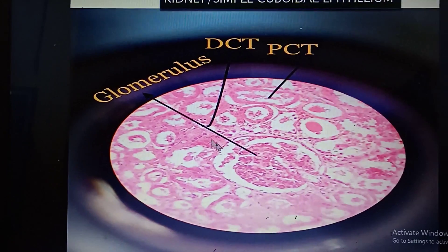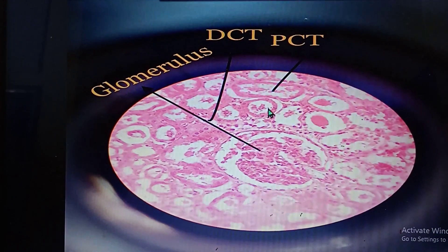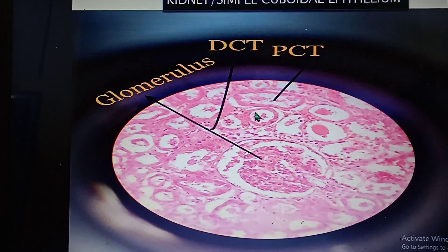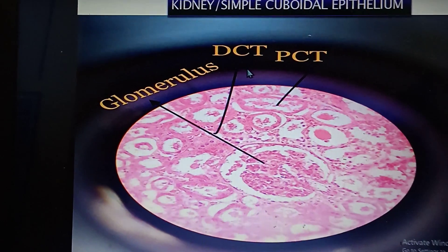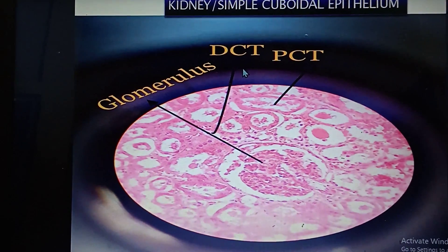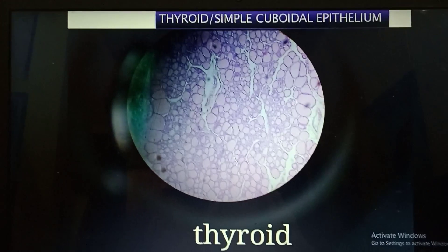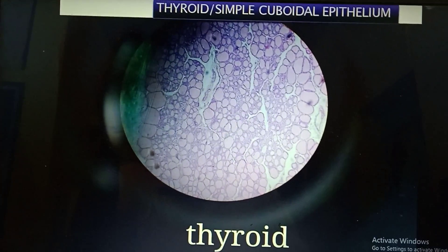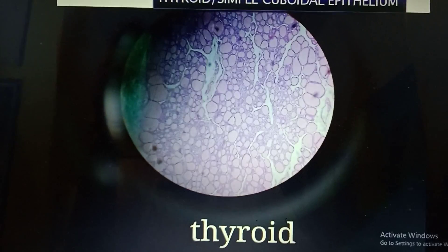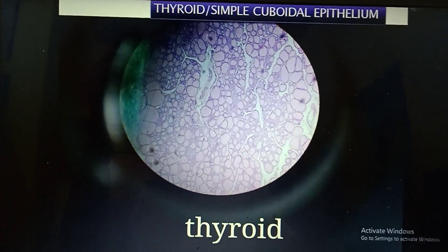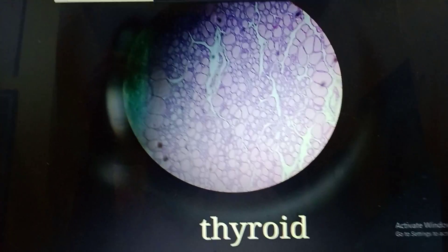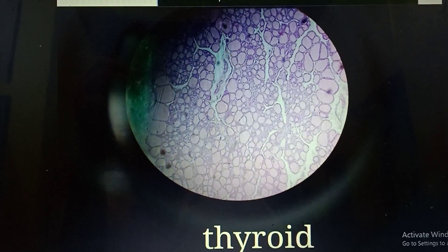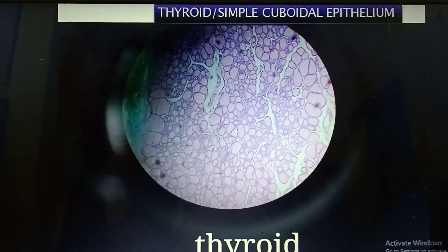This is simple cuboidal epithelium found in the kidney in the proximal convoluted tubule as well as the distal convoluted tubule. This next slide is also simple cuboidal epithelium in the thyroid — it looks just like people standing on a sea coast — and because the follicles are filled with thyroglobulin, it is simple cuboidal epithelium.